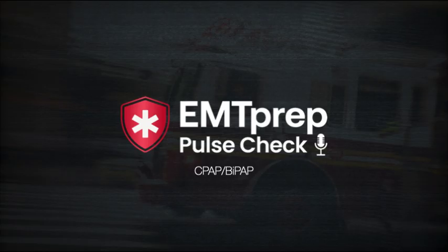The correct answer here would be B, BiPAP with an IPAP of 10 and an EPAP of 5 with inline albuterol treatment and IV therapy. This patient is in significant respiratory distress and is most likely going to rapidly decompensate without aggressive management. So initiating BiPAP to help with gas exchange and ventilation, initiating albuterol to open those constricted lower airways, and establishing an IV would be the best treatment of the provided options.